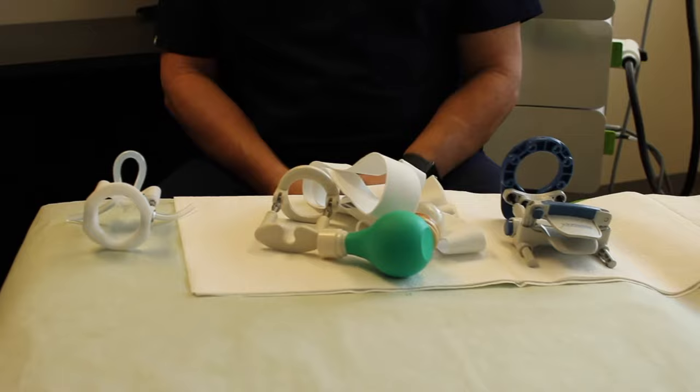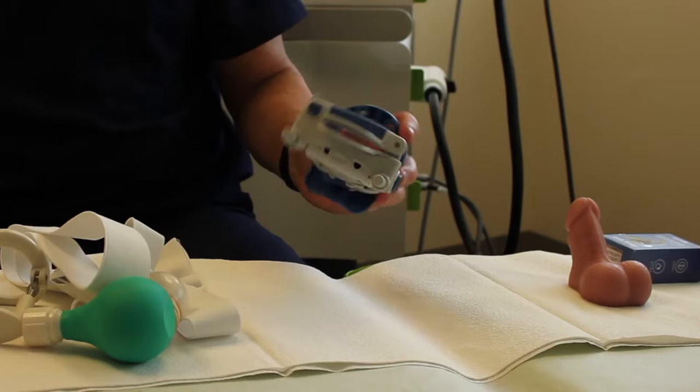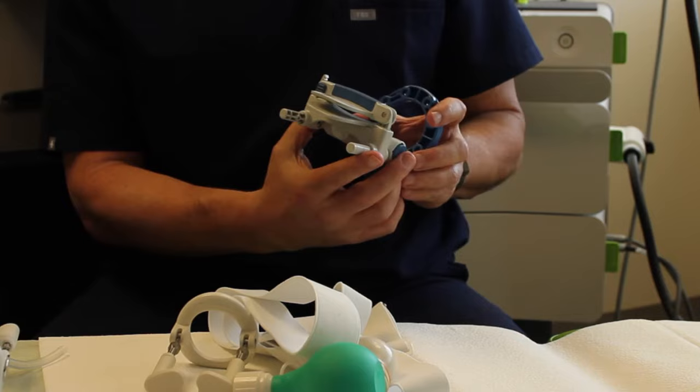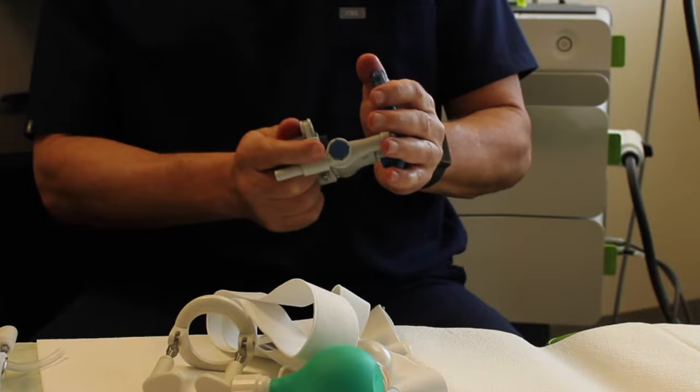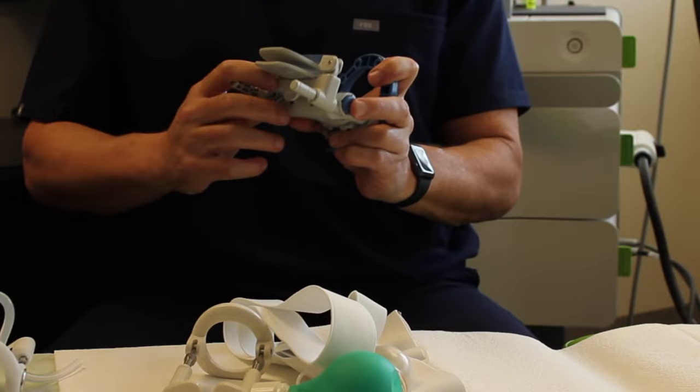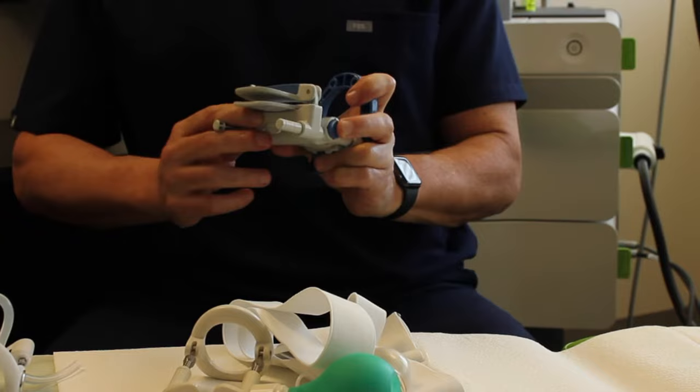On my left is the Restorex, the most expensive of all three devices. However, it's very well engineered and comes fully assembled, other than if you need to add further extensions. It has a number of positives, including the ability to lock and unlock the traction device, and you can also tilt your penis when you're trying to remodel a Peyronie's flexion.